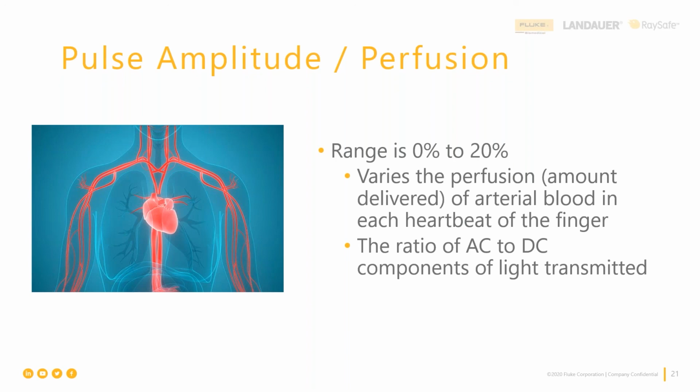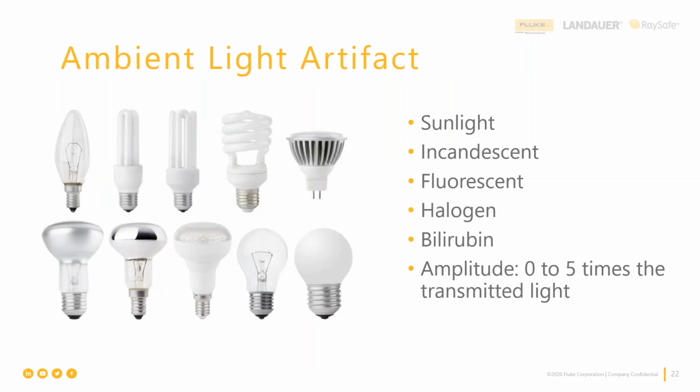Yeah, it's important to note how intertwined all of these vital sign parameters are within the human body. We've touched on quite a few in this, and we're trying to focus just on pulse oximetry. So it really is a complex system. Right. Your body isn't just one organ. It's the combination of all of them. Let's talk a little bit about ambient light artifact.